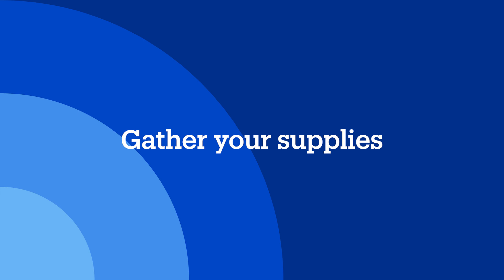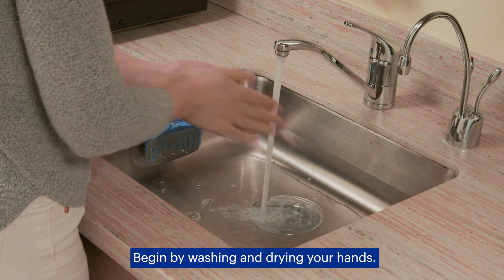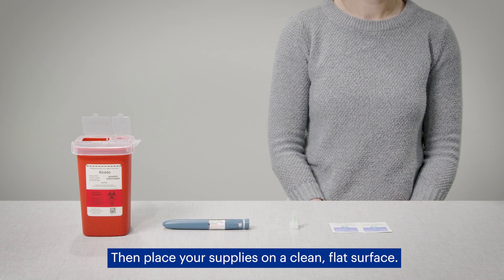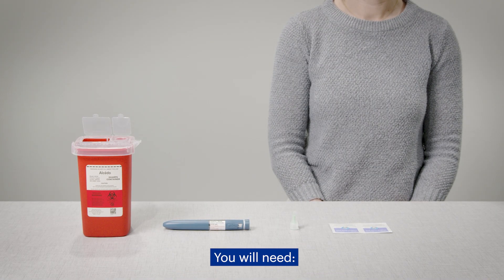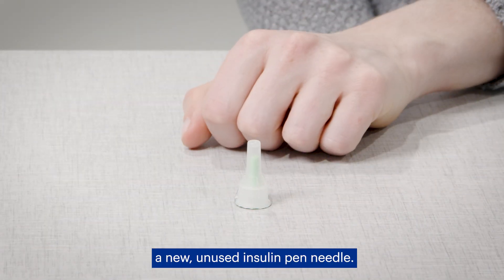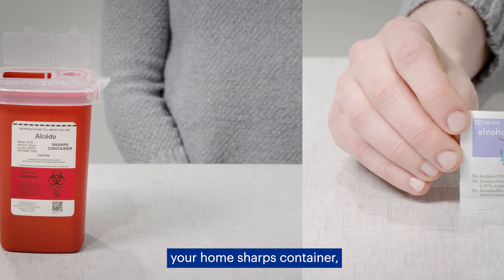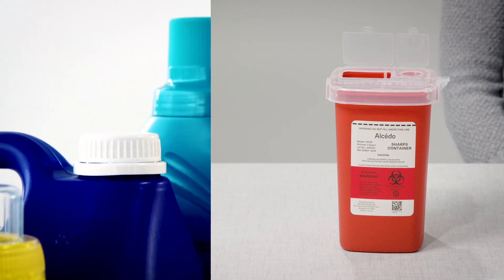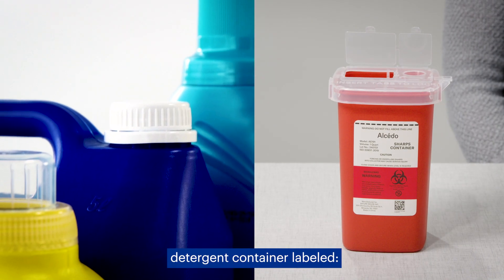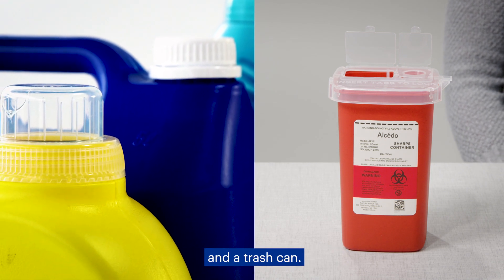Gather your supplies. Begin by washing and drying your hands, then place your supplies on a clean, flat surface. You will need your insulin pen, a new unused insulin pen needle, two alcohol wipes, your home sharps container — such as an empty laundry detergent container labeled 'home sharps, not for recycling' — and a trash can.